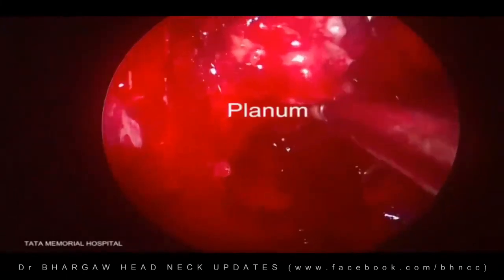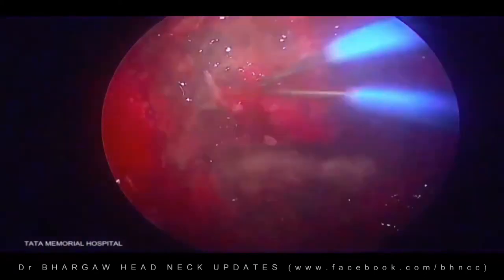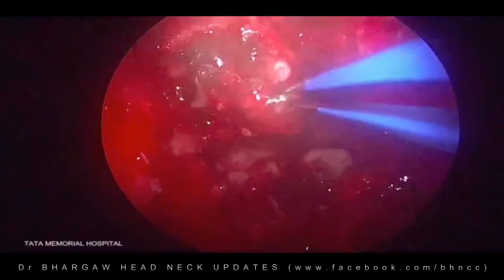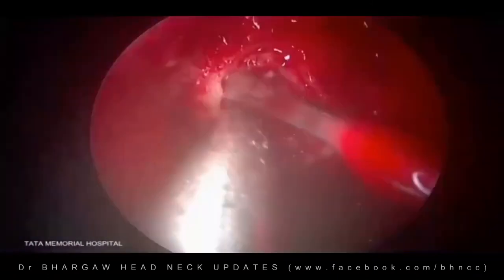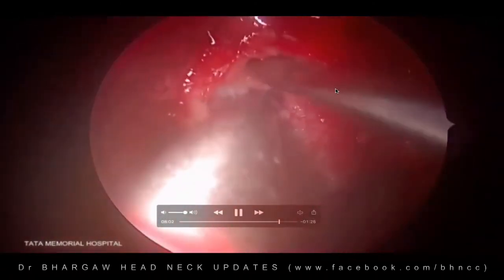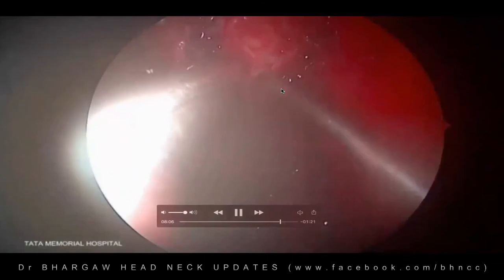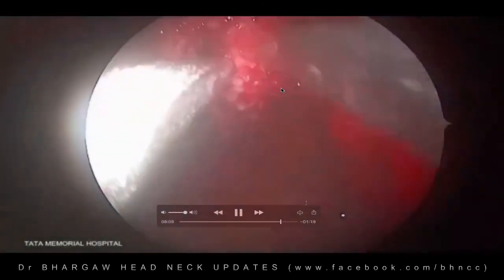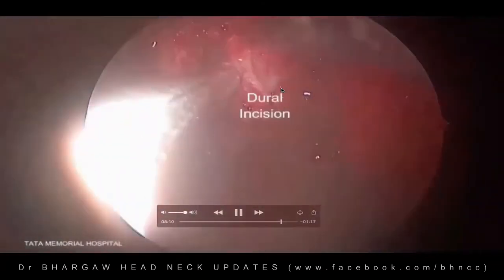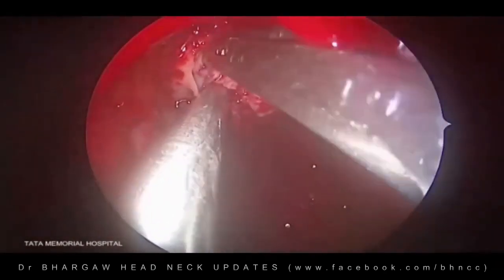So that's the planum area where we're drilling. And here, as you're dealing with the olfactory fibrils, you'll have some amount of CSF leak. You drill and then you expose the dura all around here, as you see. And at this point, you're doing a four-handed technique. You're not doing it with one hand. It has to be a four-hand technique, and you have your neurosurgeon with you. So I definitely have a neurosurgeon with me at this time.